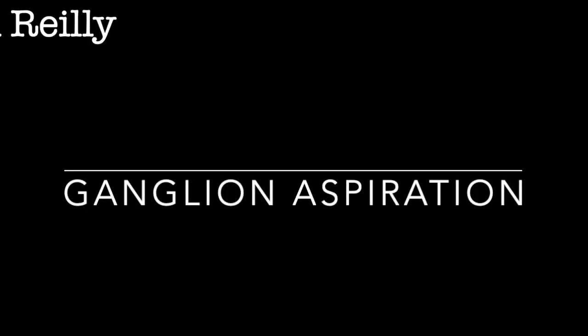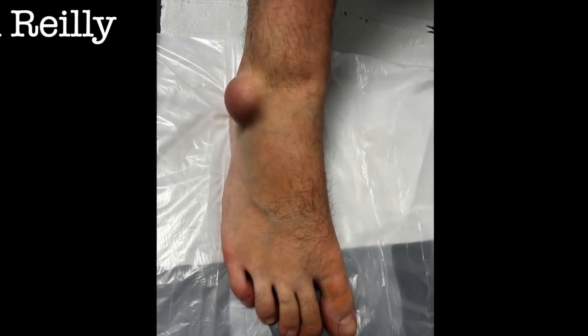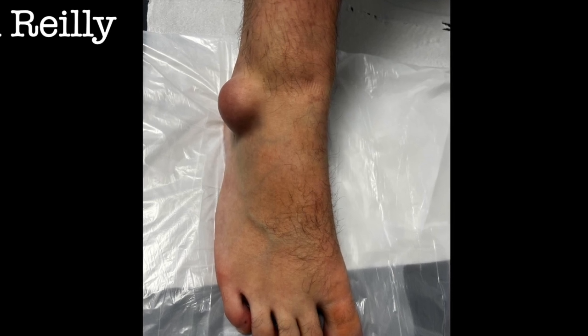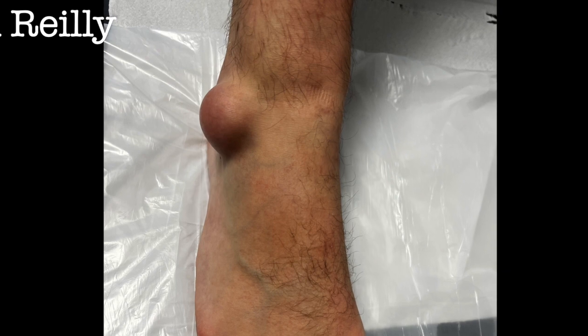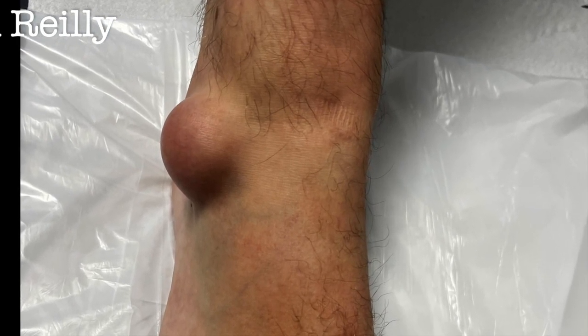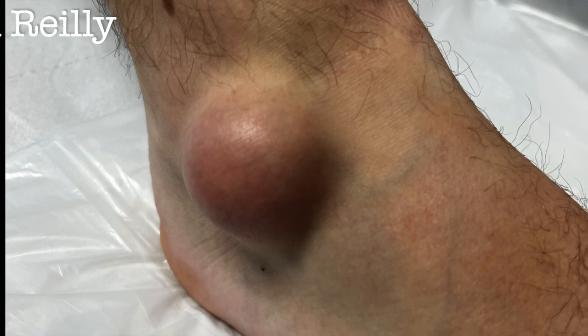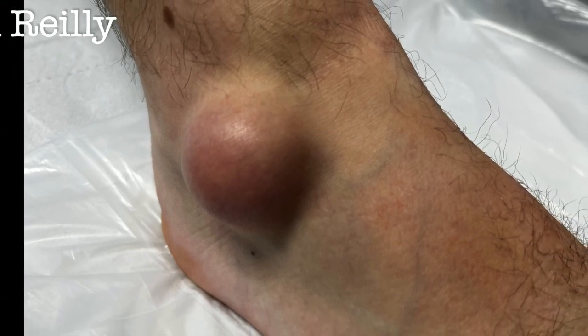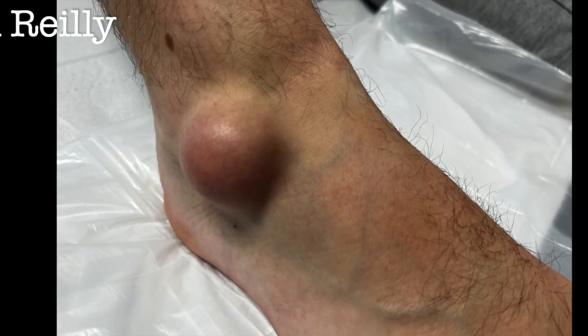Coming up this time is a ganglion aspiration. A young lad came to see me with a large ganglion on the distal dorsolateral aspect of the ankle. You can see it there — looks like a golf ball. It was quite sore. We like to aspirate for diagnostic purposes and he was keen to get it aspirated and get some of the fluid off. There's a view from the oblique side — really quite a size, certainly the biggest one I've had for a while. Always worth trying to get some fluid off for diagnostic purposes.